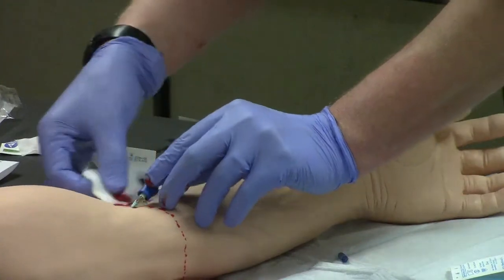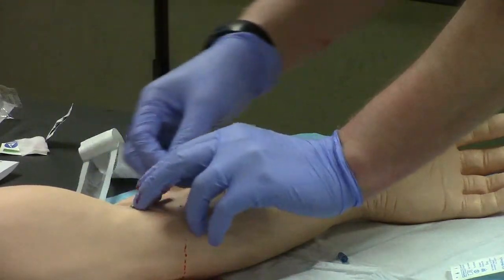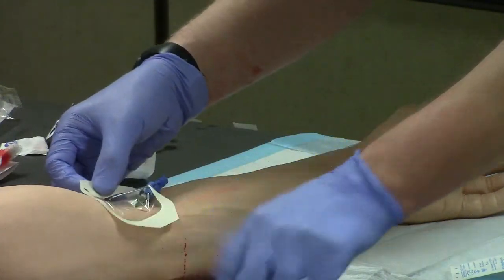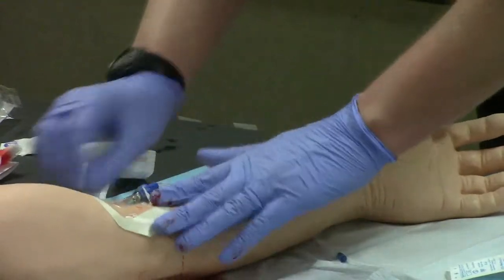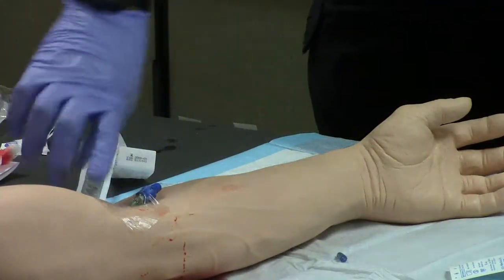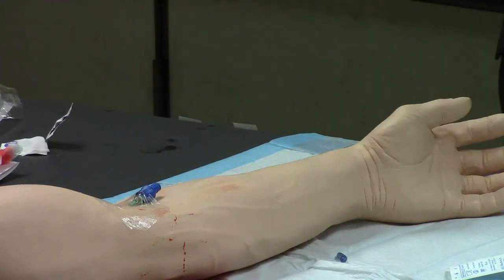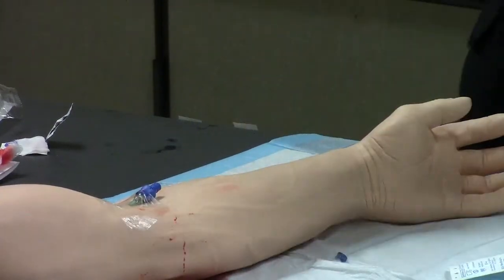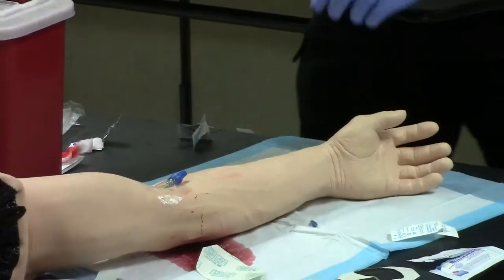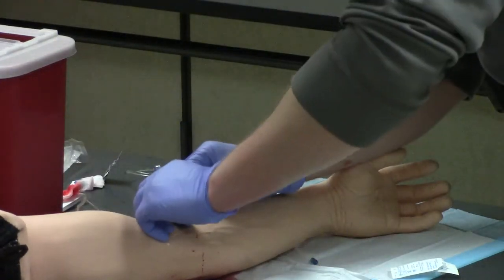This is where that 2x2 comes in handy — we can go ahead and clean up some of this blood so that my tegaderm sticks better. The tegaderm goes on in place so we can see the puncture site, monitor it, make sure there's no infiltration as we flushed, and make sure it doesn't become red or irritated. Now that our saline lock is in place, we're going to attach some fluid. Because I was touching the lock, we're going to clean the end of the saline lock, then grab the fluid, remove the end cap, and screw the line onto our lock.